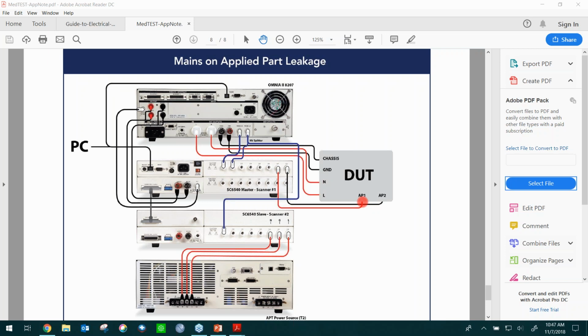Now, this voltage that just fell on me may kill me because it's an accident. But does that allow your product to leak more current or provide a path for this voltage back down to ground? Because if your product provides a path to ground, it would create a shock hazard or more severe effects on the human body that's connected to it. So you're simulating voltage falling onto your applied part through an MD and any resulting path that it may create through your product. Now, there are tests previous to this that ensure that this doesn't happen, but this is just a verification on it.